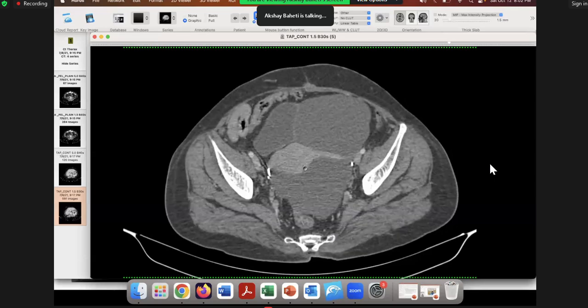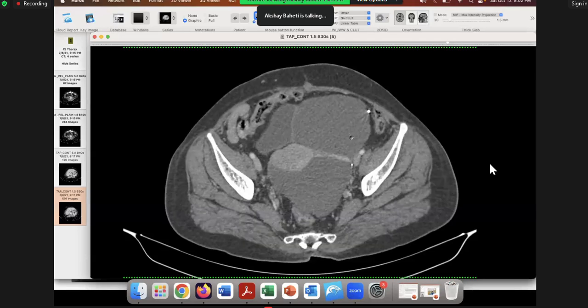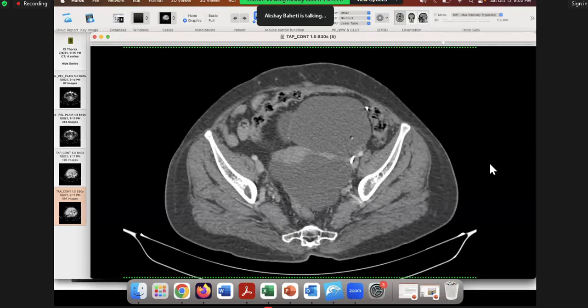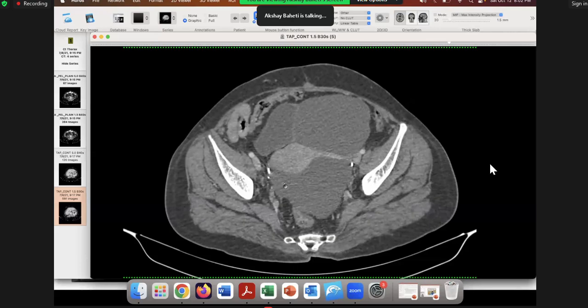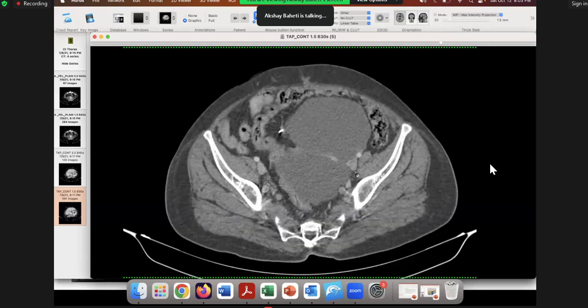But basically, there are adhesions. Every cycle, every menstrual cycle, the ovary ends up secreting some fluid, doesn't it? So whenever the ovary secretes fluid, with every cycle, what you see is the fluid gets stuck in those loculations. So with time, this becomes an inclusion cyst, and the ovary keeps secreting, so it keeps growing slowly in size. So the classic thing for a peritoneal inclusion cyst is two actually. One is, of course, that it will follow the contour of the pelvic cavity in a patient who has history suggestive of adhesions, meaning prior cancer, prior TB, prior infection, inflammation, something which causes adhesions.